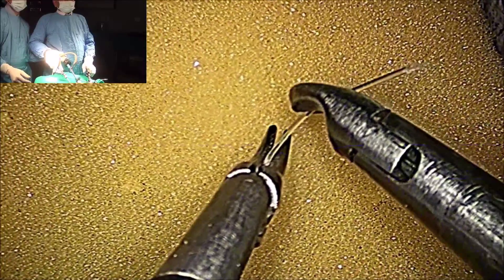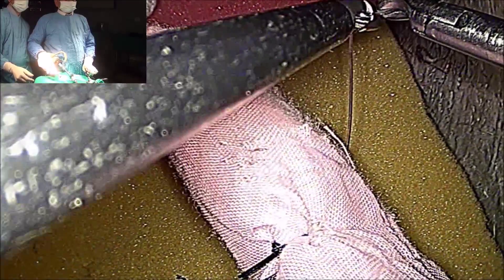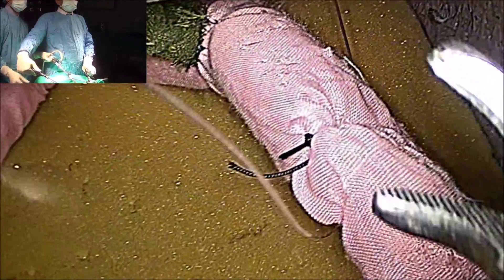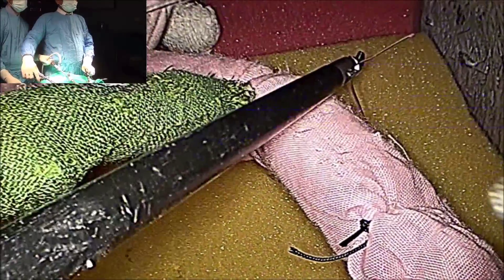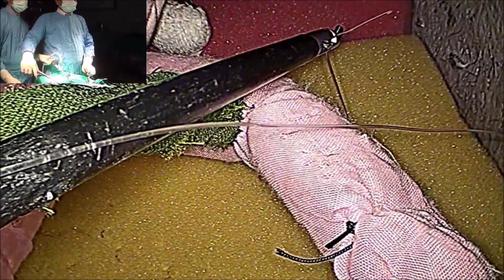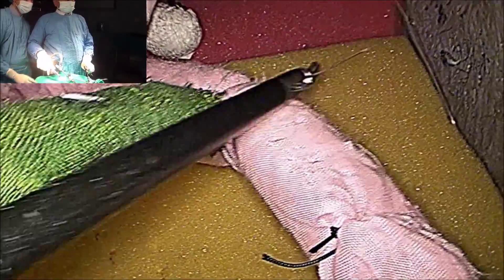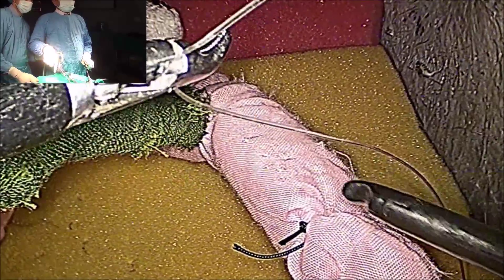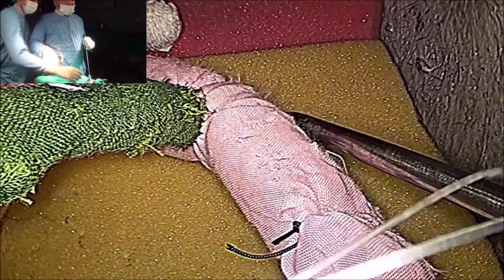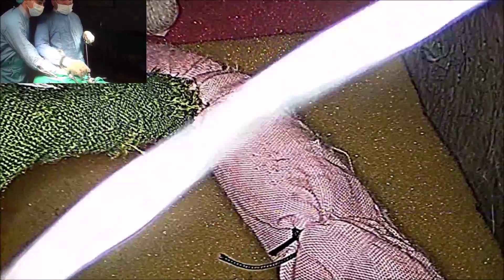A window is already there. Bring the Maryland out and catch the suture from the other side. After that, feed the suture in so that there should not be any shearing effect when you pull it out. You can keep one instrument behind as well to prevent any shearing effect. Now the suture is out.